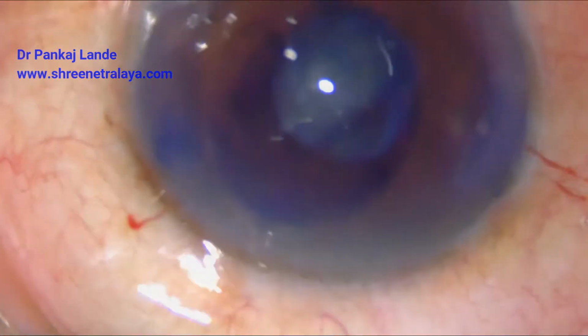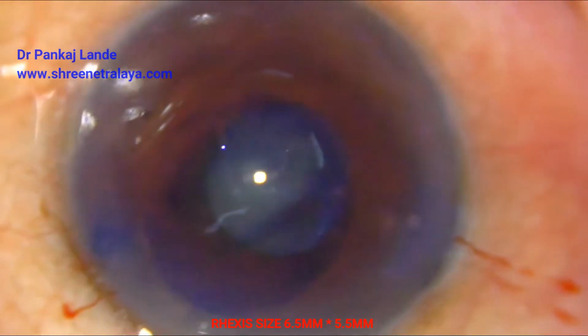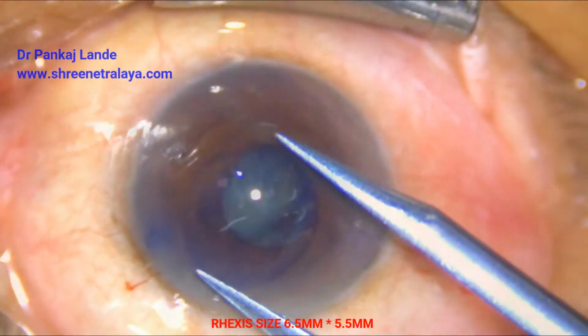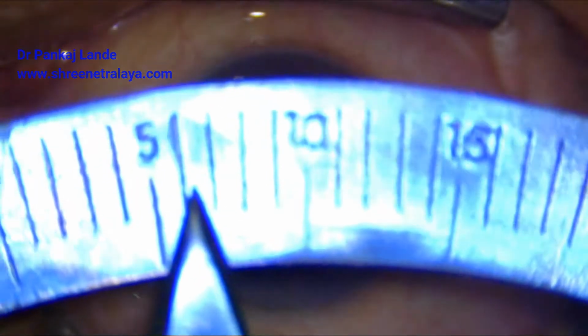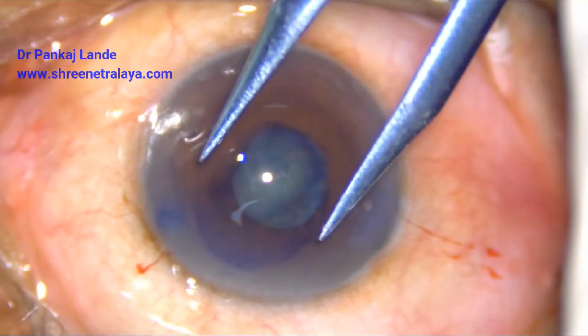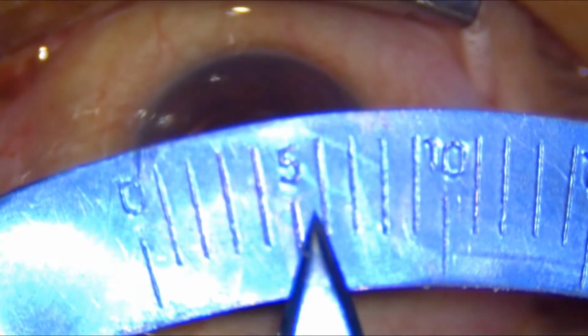As you can see, it is a bit oval in shape. On one side it is showing 6.5 mm. On the other meridian it was 5.5 mm. So that much rhexis for a grade 2 cataract was enough for me to manage my case.